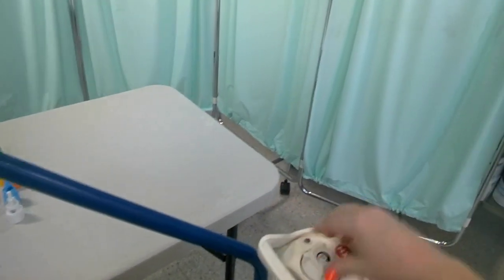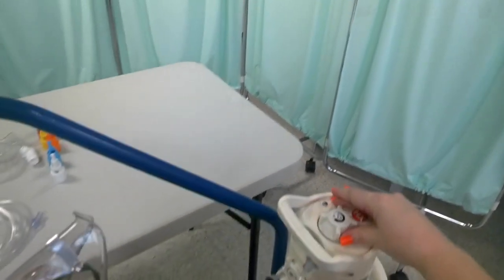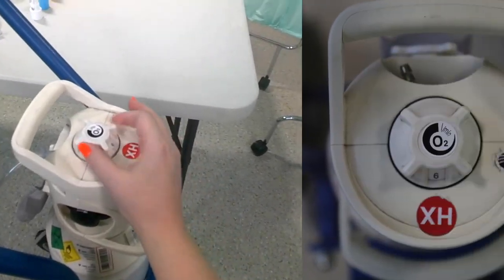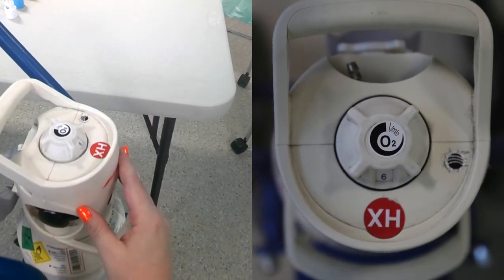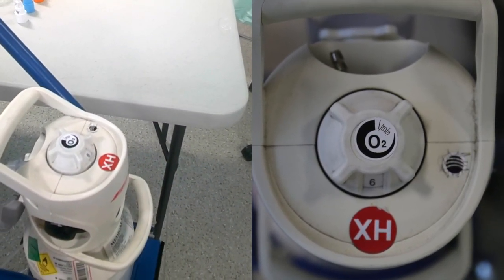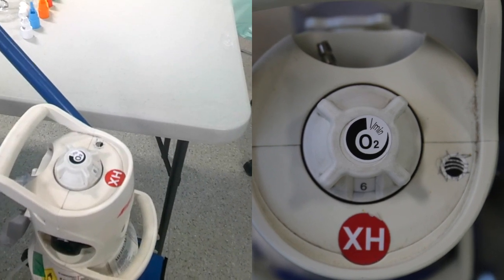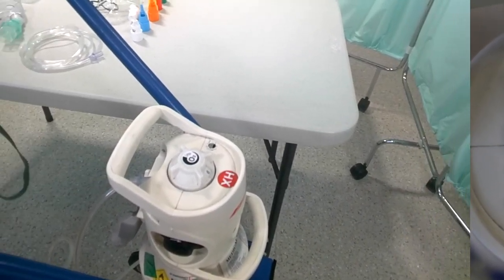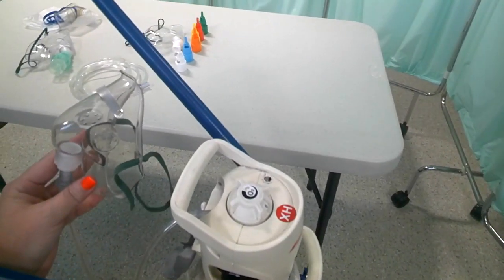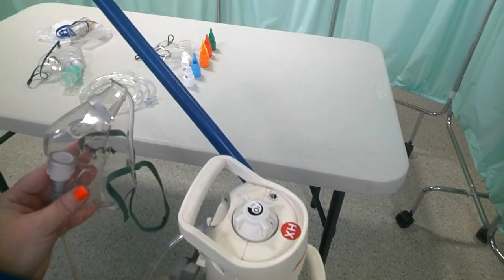The golden rule is to always have your flow rate going through the device before connecting the patient. It's running at 6 liters per minute flow rate at the moment, so I can now go and attach this mask to my patient's face safely.